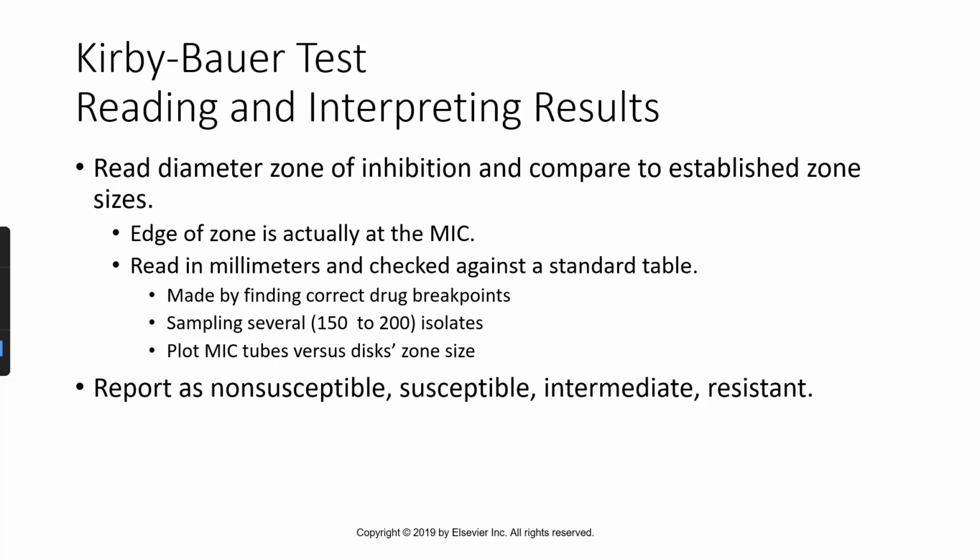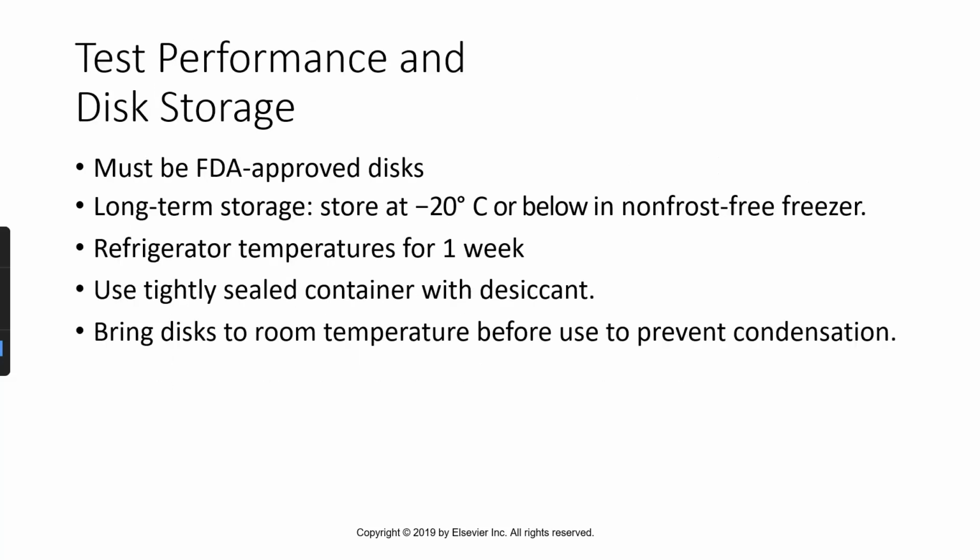The edge of the zone is actually at the minimum inhibitory concentration. You read in millimeters and check against the standard table and report as non-susceptible, susceptible, intermediate, or resistant. You must be using FDA-approved discs.